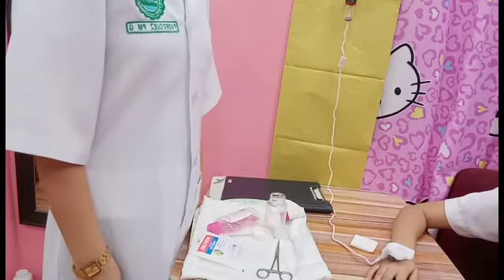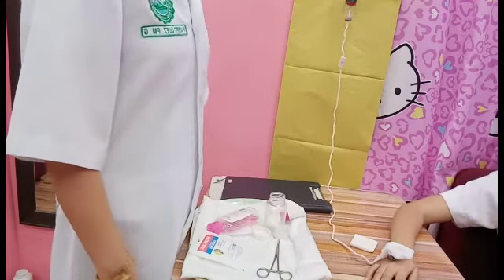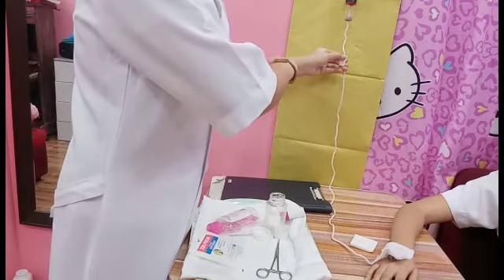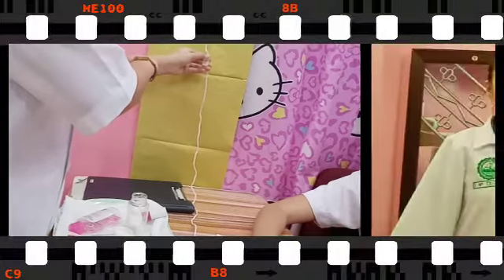Then, regulate the IV flow according to physician's order. Next is to attach to IV tubing tape or label that states date, time, and your initials. Label container and record procedure according to agency policy. Discard used equipment in proper manner and wash hands.